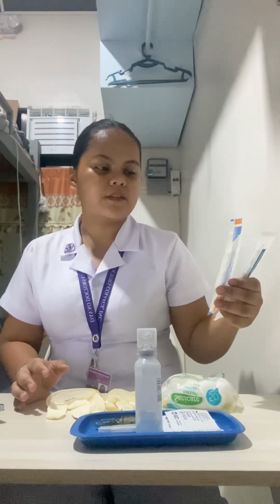After doing those 3 steps, I am now going to organize the equipment I need to use. I have here 2 syringes, for the ampule and the vial. I have here the alcohol swab, an ampule, a vial, and a filter needle, as well as an alcohol and clean working gloves.